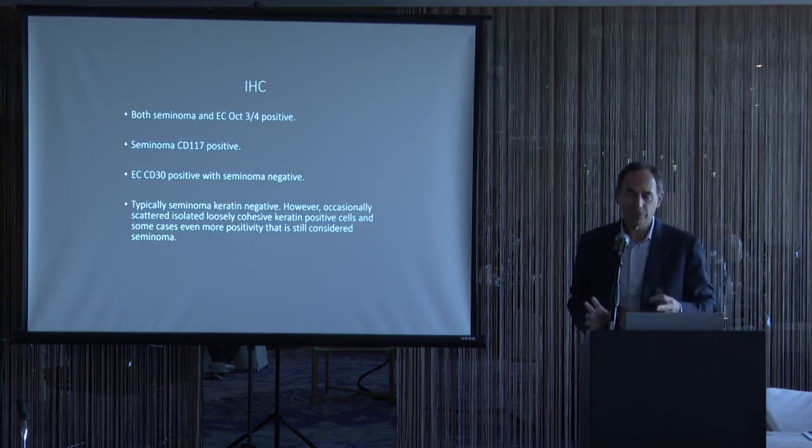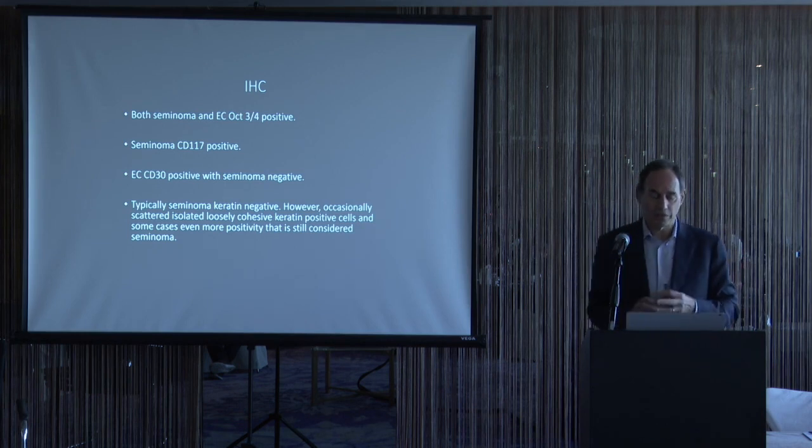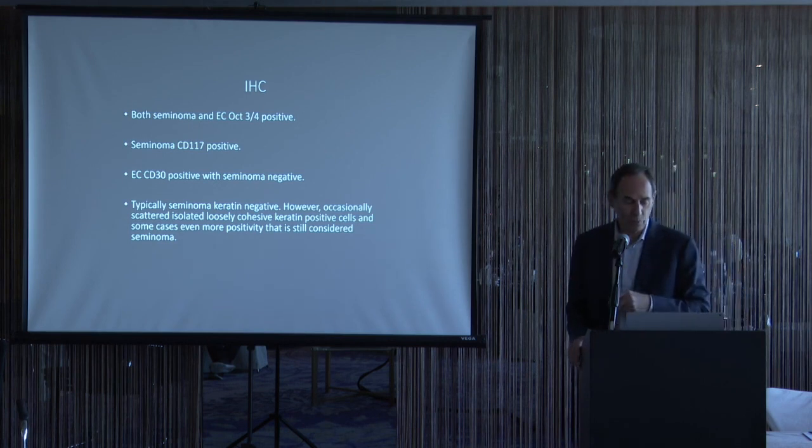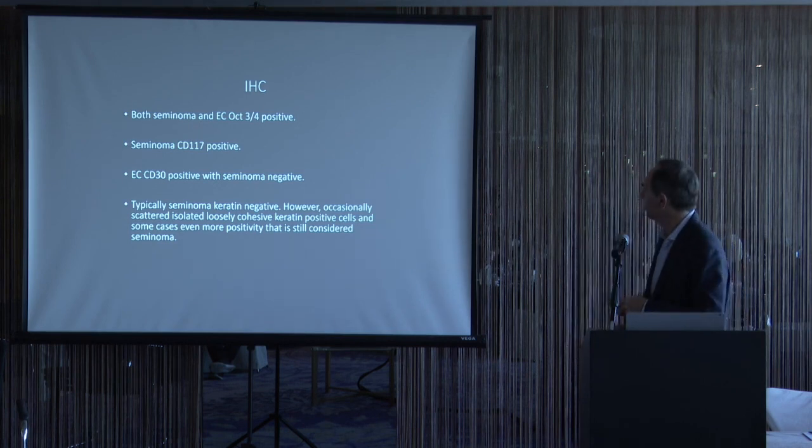Now, there are some pitfalls with immunohistochemistry that you have to be aware of. So both OCT3-4, which is a good germ cell marker, is positive in seminoma and embryonal carcinoma. Seminoma can be c-KIT positive. And then CD30 is good for embryonal carcinoma, seminoma negative.